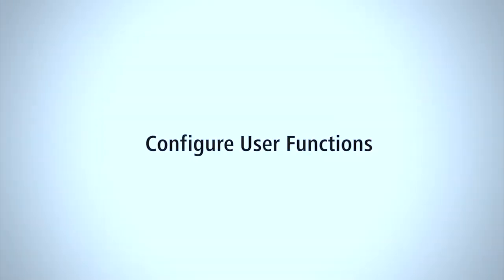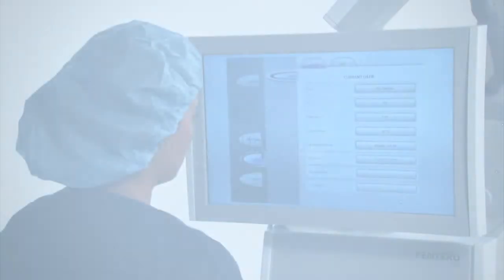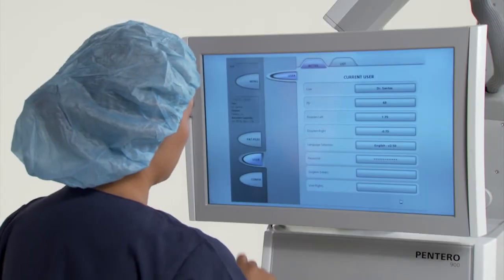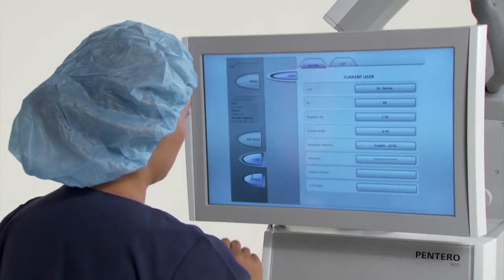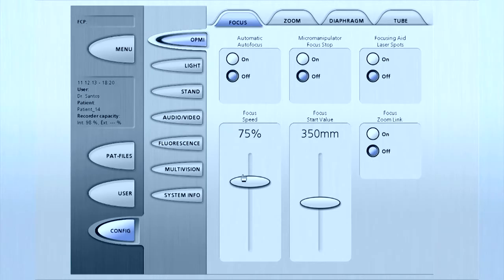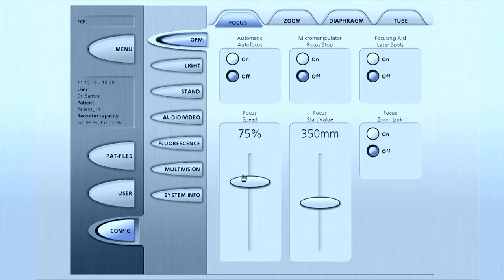While in the user profile, select Config on the far left to change default settings. You can select on the menu on the left-hand side, beginning with OPME, user function settings to be saved under the open user profile.